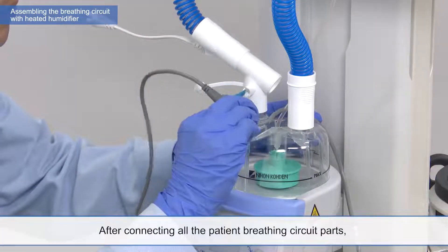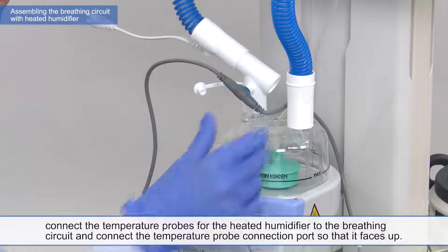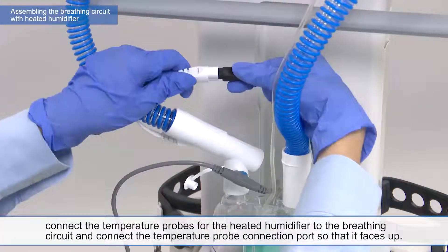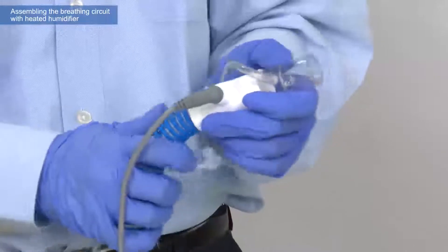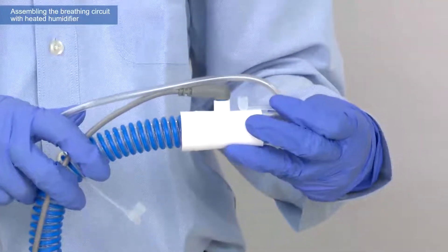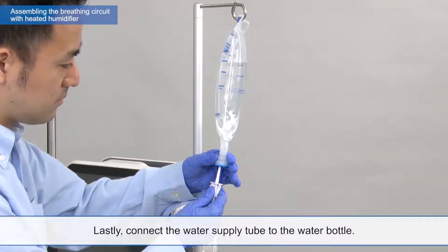After connecting all the patient breathing circuit parts, connect the temperature probes for the heated humidifier to the breathing circuit and connect the temperature probe connection port so that it faces up. Lastly, connect the water supply tube to the water bottle.